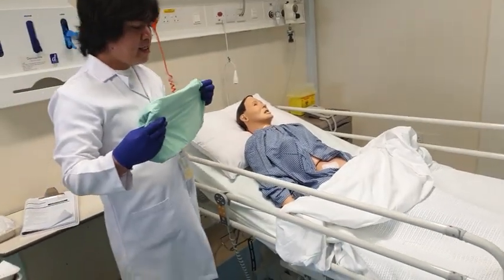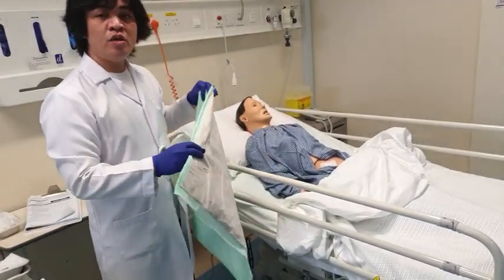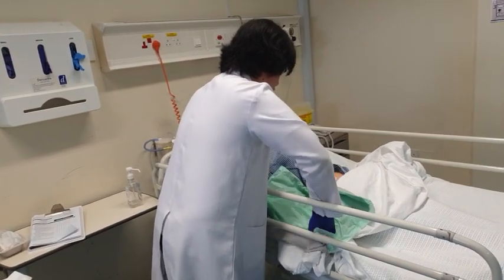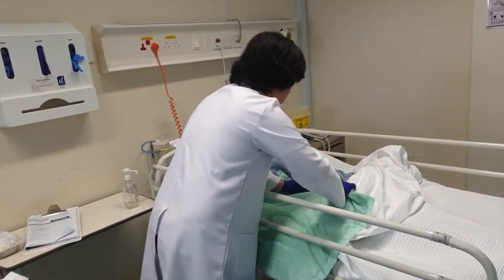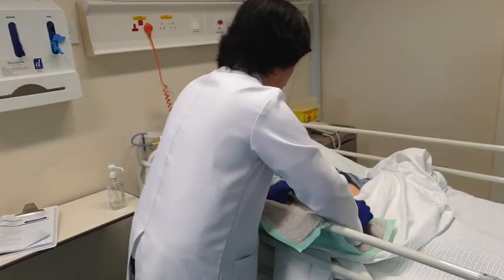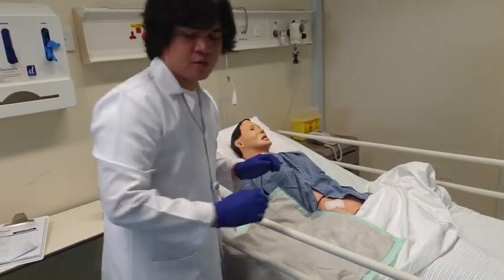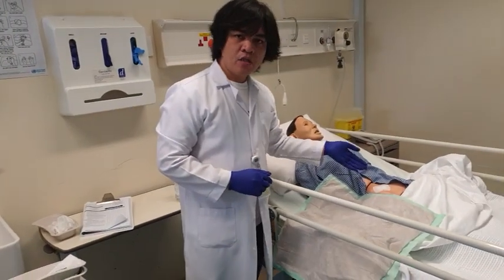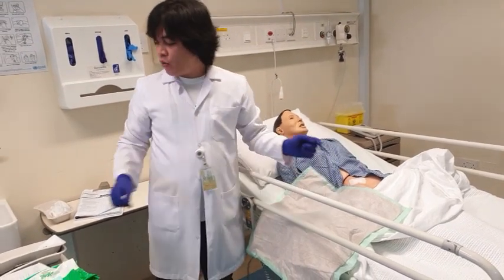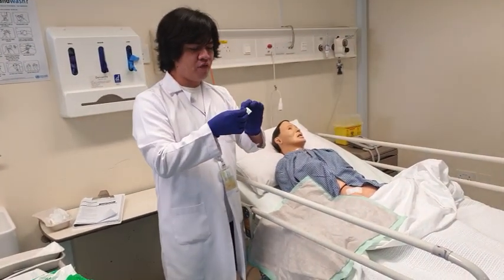And we have here the Inco sheet or Inco pad. This will prevent soiling of the bed. You should put it here. So at this point, the old dressing is exposed. What I'm going to do now is to remove this old dressing with the use of adhesive remover. This is adhesive remover.